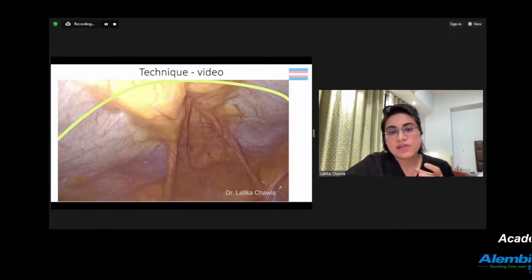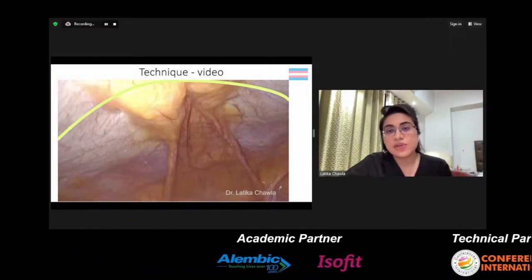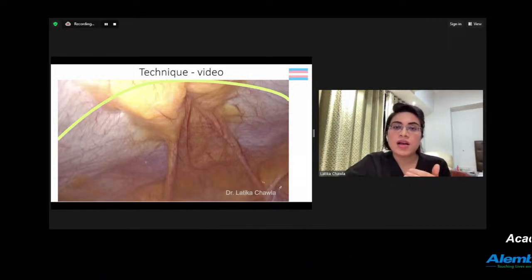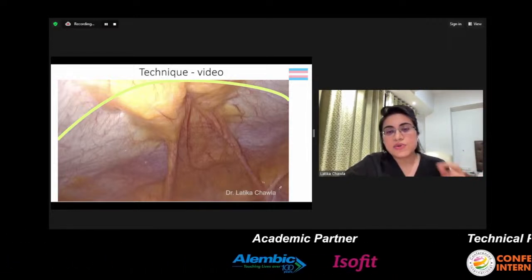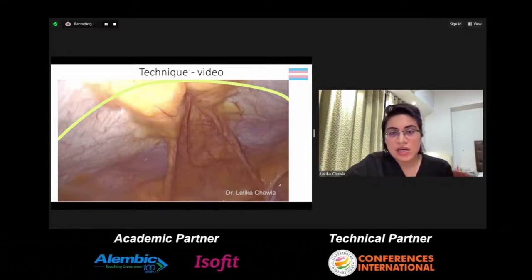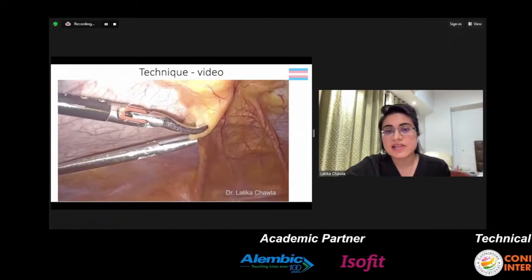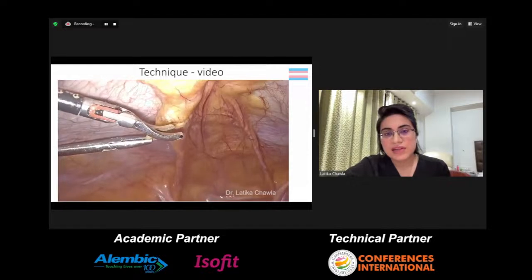In patients that have a smaller lower segment or infraumbilical area, we need to even go supraumbilical in these cases. The only disadvantage is that there are greater chances of buttonholing as you keep going superior because the peritoneum is extremely thinned out. And when you try to dissect the peritoneum too much, you create a lot of buttonholes. The idea here is to always remain beneath the plane of the median umbilical ligaments. As you can see here, the umbilical ligaments are seen very, very clearly. We make an incision around the level of umbilicus here.